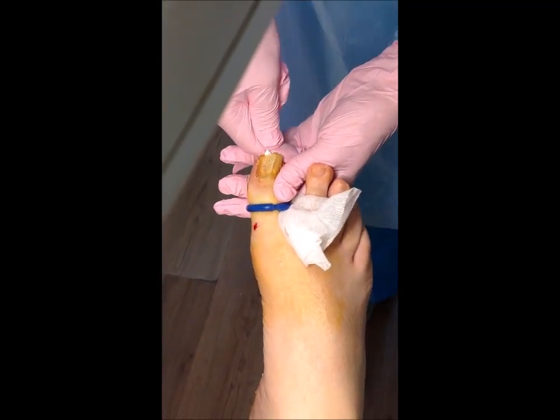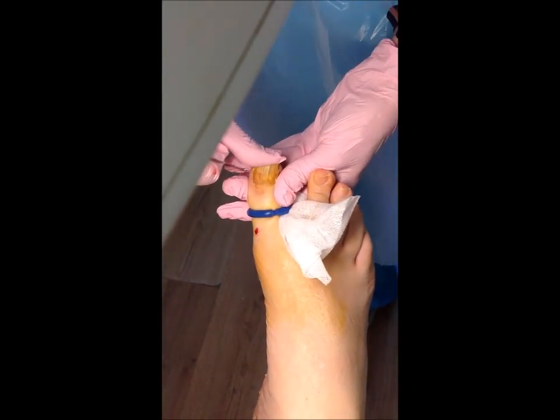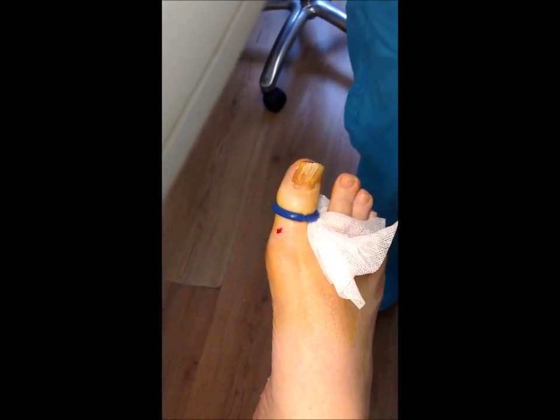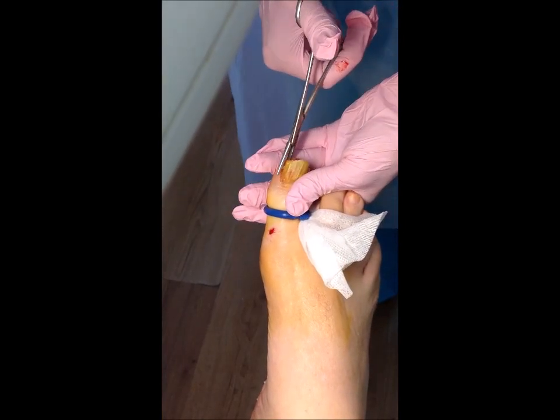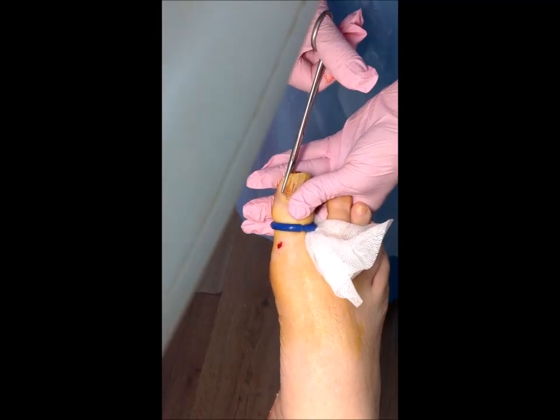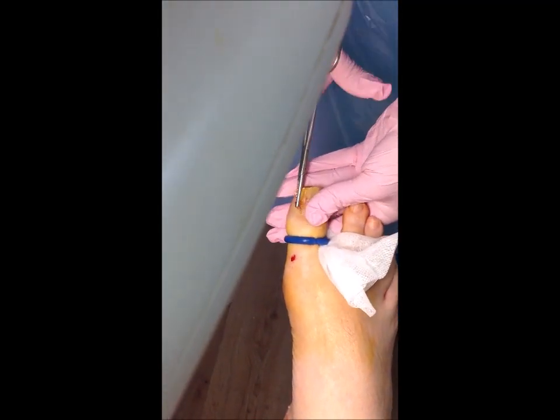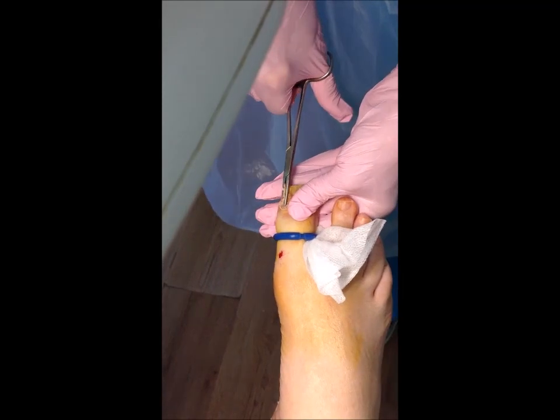So that nail is now loose. I get a pair of forceps, take that down to the base, clamp on, and then we gently just begin to prise that side away. You can see how far it goes down into the corner there, then go to the other side.